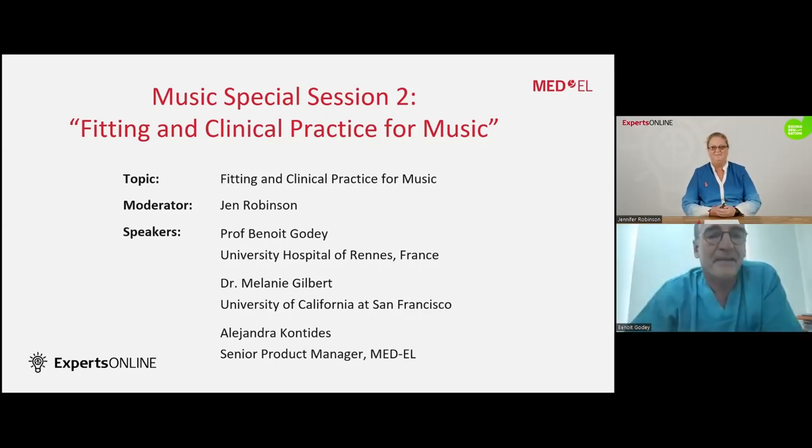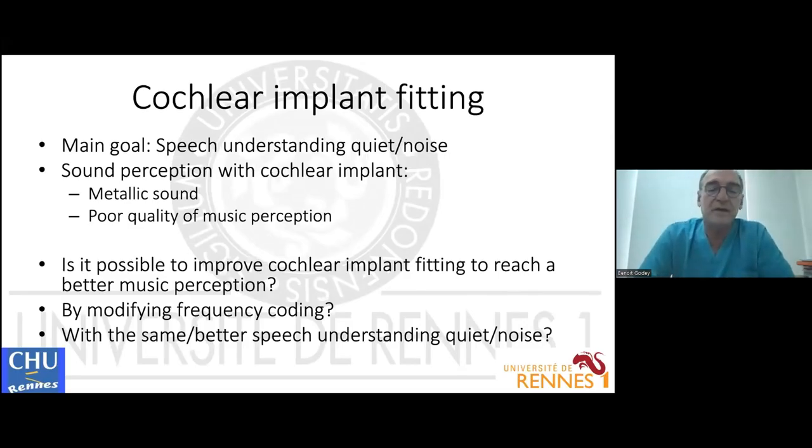Okay, thank you very much, Jennifer. It's a great pleasure for me to be here. I start my presentation. Thank you very much for giving me the opportunity to present our studies about cochlear implant fitting and music perception. We know that the main goal of a cochlear implant is to improve speech understanding in quiet and noise. And we know also that the sound provided by a cochlear implant is less natural, is metallic, and is of poor quality for music perception.